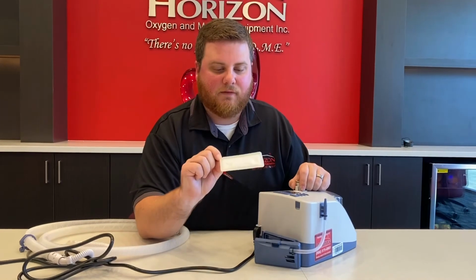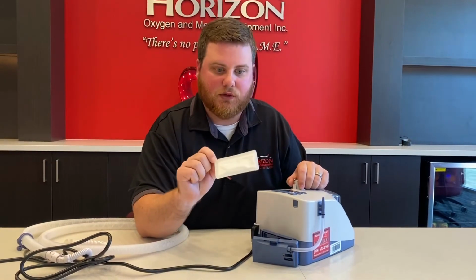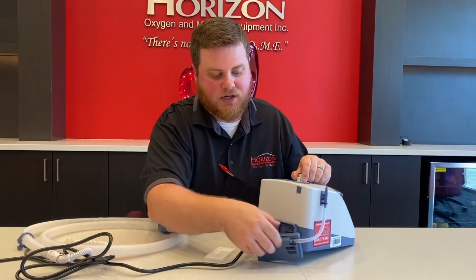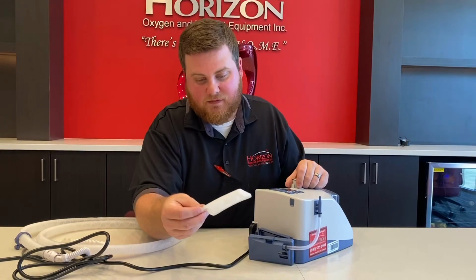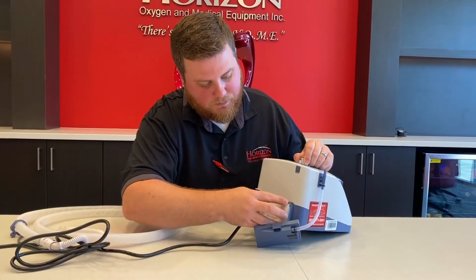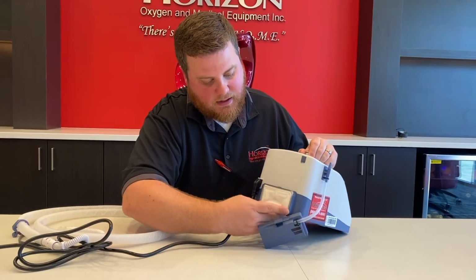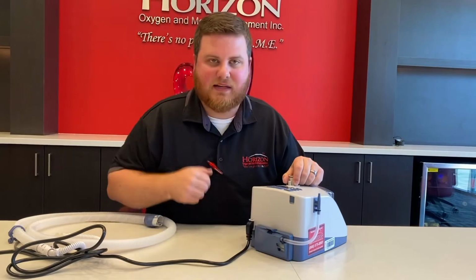So every 3 to 6 months, just depends on how many hours of use, we replace this filter. But if it ever comes detached or they ever knock this off, we can help with that if they need it, but all they have to do is bring this filter back, insert it right to the back, it kind of locks into place, and then you take the cover and it snaps back on.